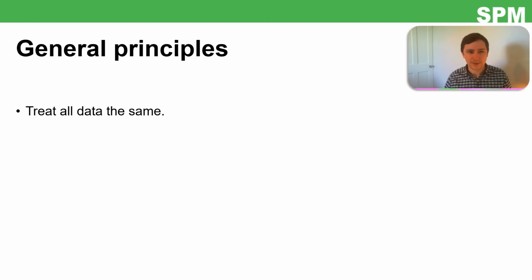So you might be thinking, well, as long as I apply the same things to all my data sets, that'll be okay. But you might find that you've designed, say, your filter parameters based on one condition rather than another, and I'll come on to that on a later slide.